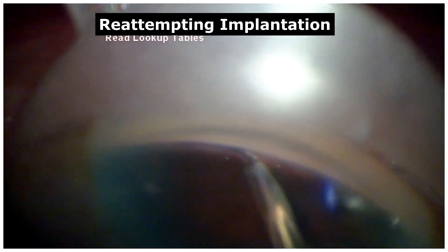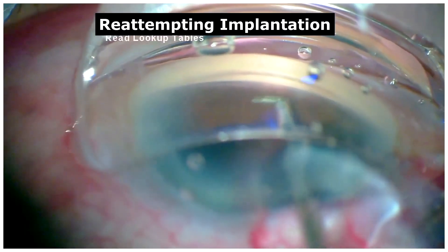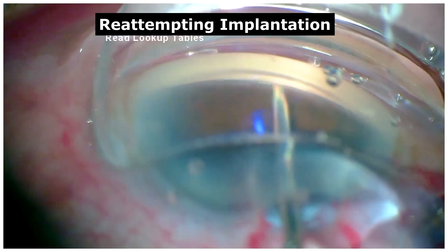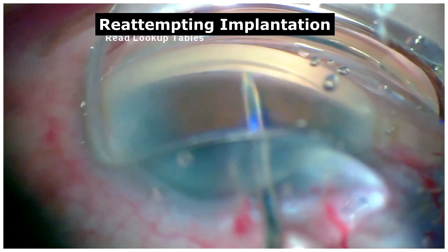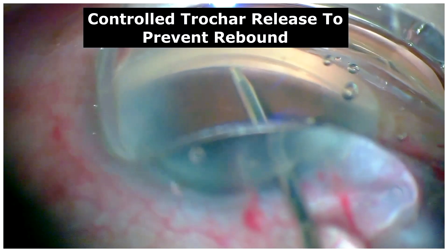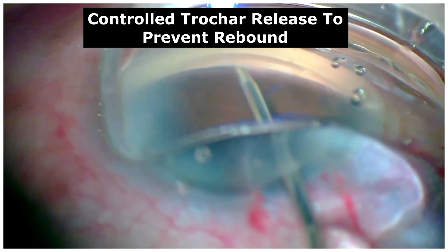To properly re-attempt an implantation, the iStent was retrieved using the trocar. Keeping in mind the trocar malfunctioning, the iStent needs to be released in a proper and controlled fashion as shown here. Once inserted, the claws need to be opened completely before retrieving the trocar.